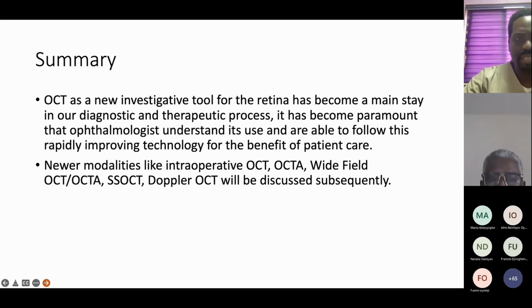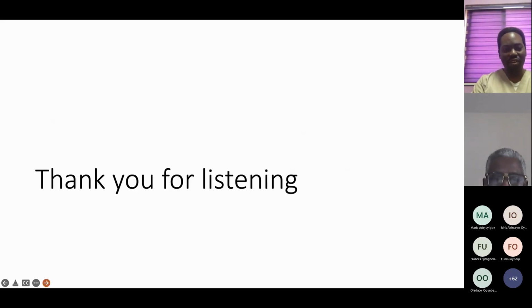It has become paramount that ophthalmologists understand its use and are able to follow this rapidly improving technology for the benefit of patients' care. Newer modalities like intraoperative OCT, OCTA, wide field OCT, SSOCT, Doppler OCT will be discussed in subsequent lectures.